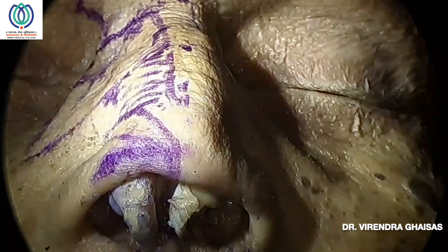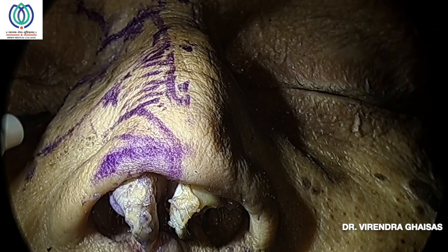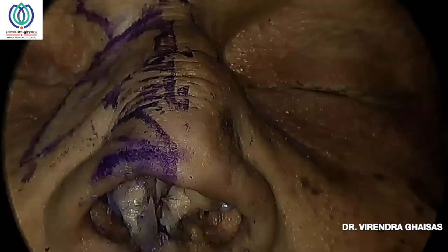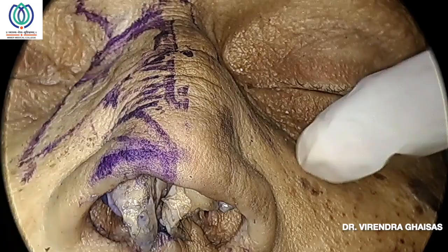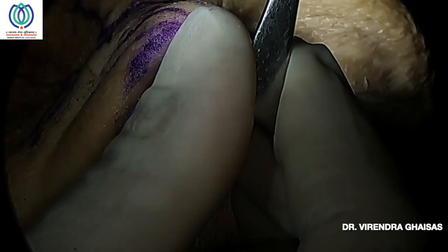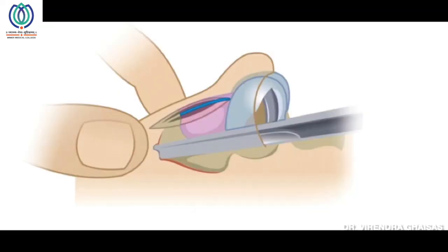Sometimes you leave a small bony fragment there to avoid a collapse of the inferior turbinate. Then we have a transverse osteotomy, which is at the level of the medial canthus, avoiding an injury to the medial canthus, till the dorsum. The paramedian osteotomy is done mainly with a 5 mm osteotome, either with an osteotome, Lindemann burr or with a piezo, whichever instrument is available, but it has to be sharp and quick, otherwise there are chances that you will have free floating bones.